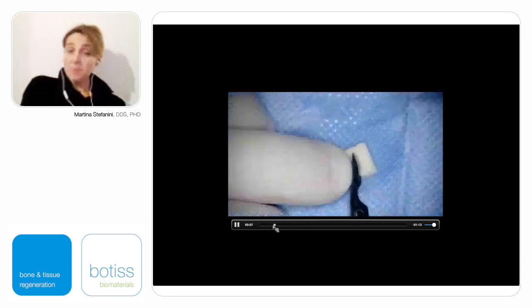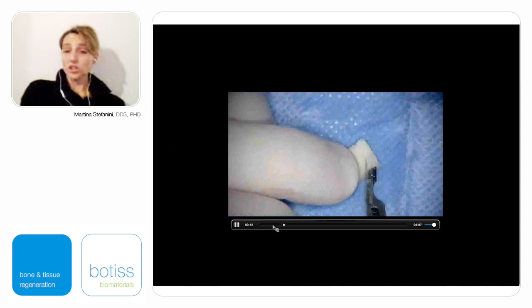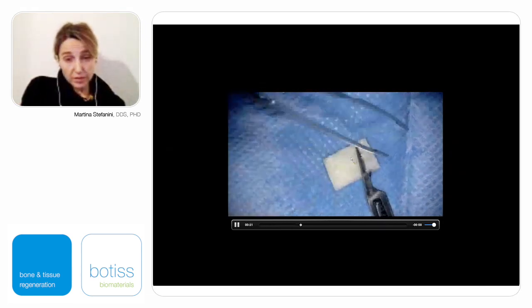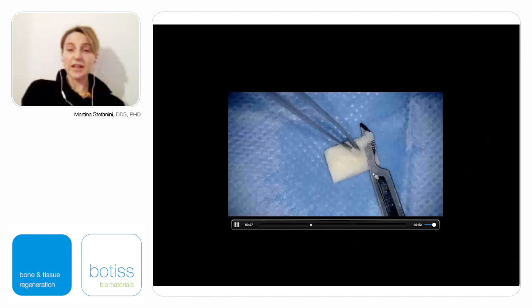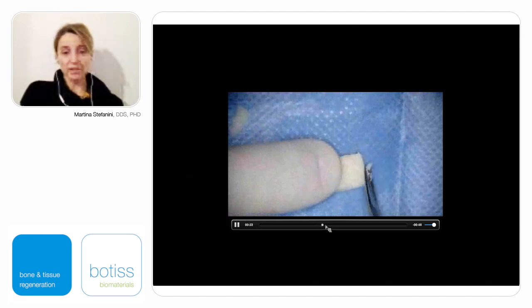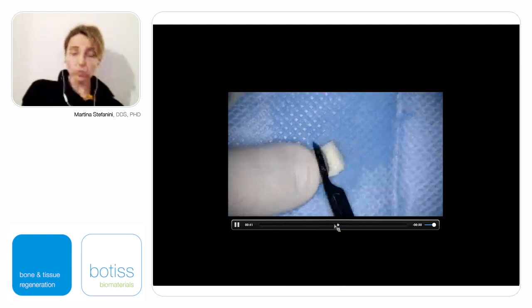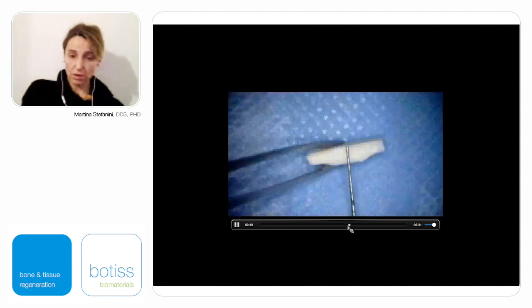The procedure consists of the same trapezoidal shaped flap design that we saw before for the treatment of gingival recession, with the use of this thicker Mucoderm that is treated maintaining the central portion thicker and reducing the peripheral aspect where we are going to fix the matrix, in order to increase the thickness of the soft tissue around this implant, to improve the emergence profile of the crown, to improve the aesthetics for our patient, and to reduce the risk of recession with time.